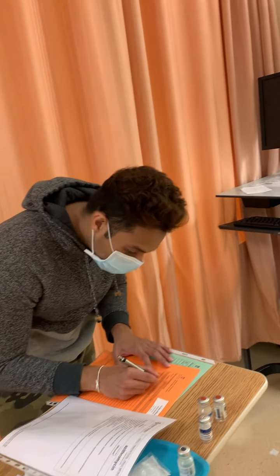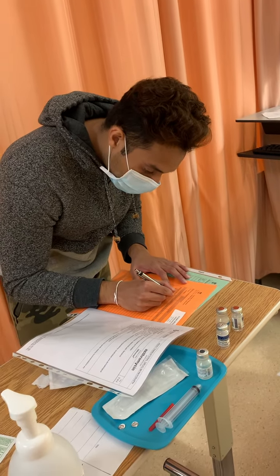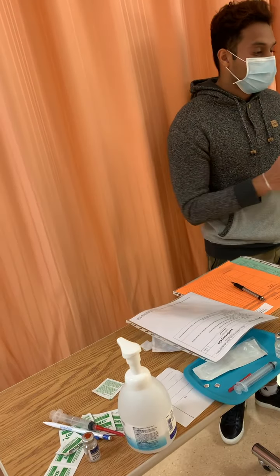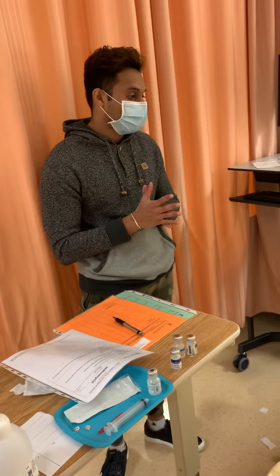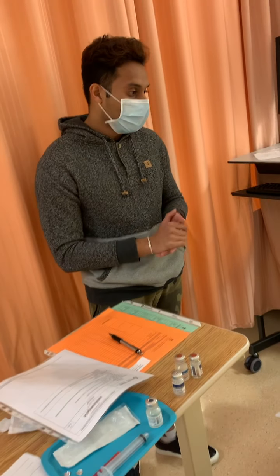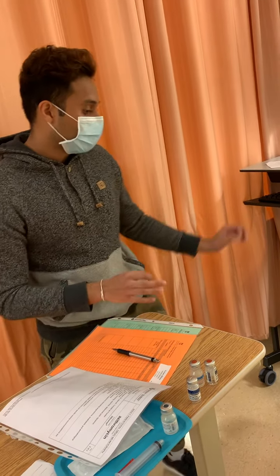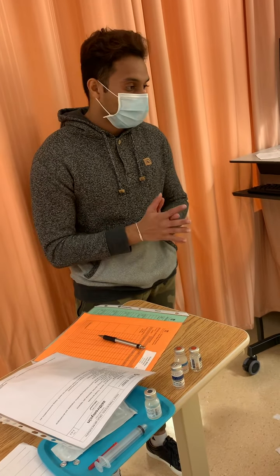So I put UMSN3, my initials, and the time. Okay, we documented that we gave the medication on our MAR. And to the patient, if you are experiencing any side effects we discussed before, just let us know with the call bell. We're there to assess you. We're gonna make sure to do a safe exit check before we leave and ensure all lines are connected and everything's good.